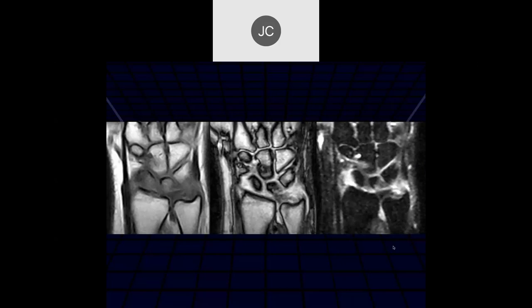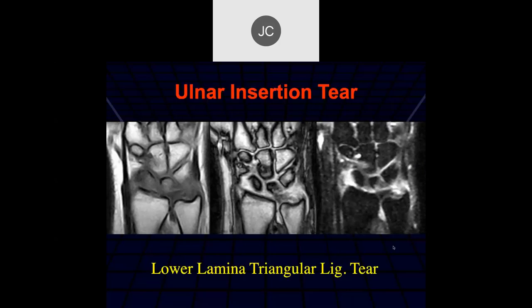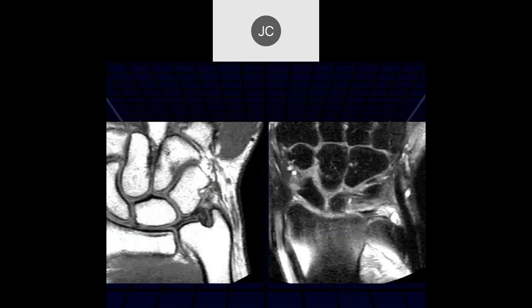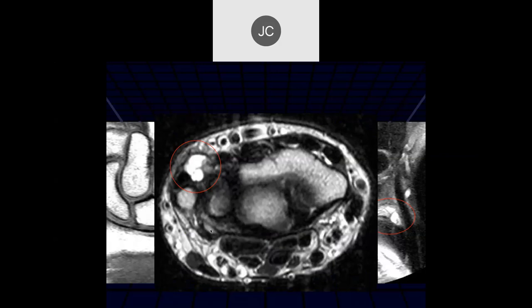Here it looks like there's some cystic change within the peripheral TFCC on the T1 — a vertical defect, tear of that lower lamina and foveal attachment. At surgery, this was an extensive tear of the peripheral attachments with cyst formation, so it was chronic.